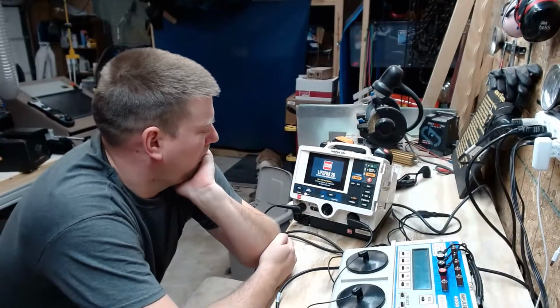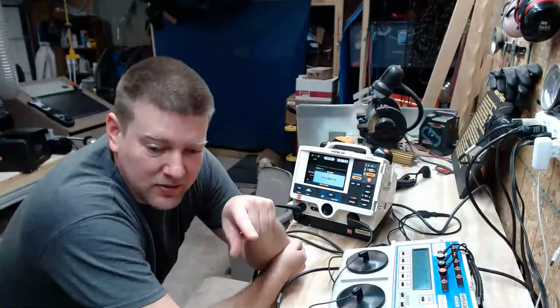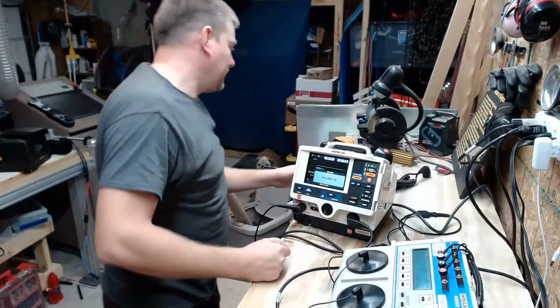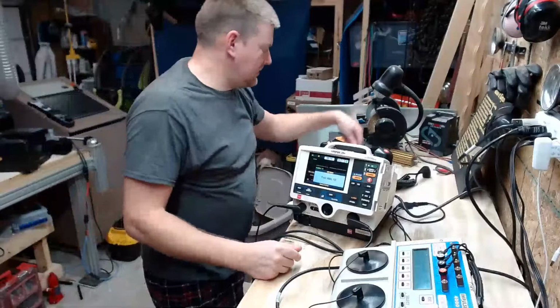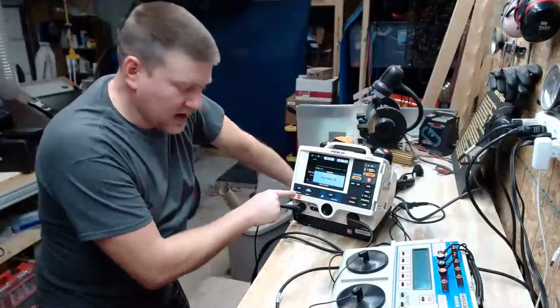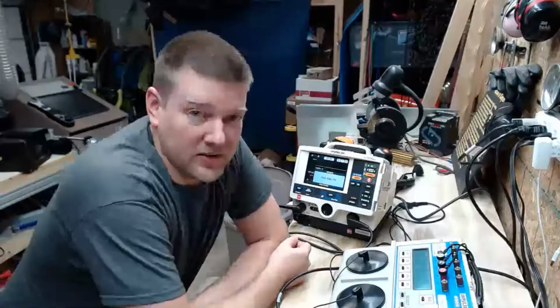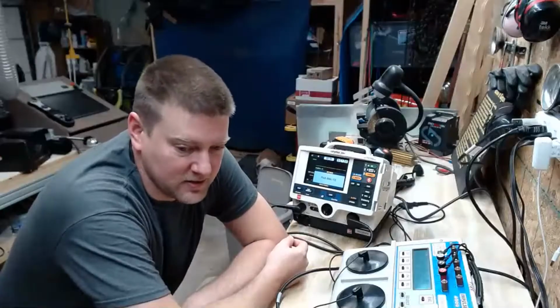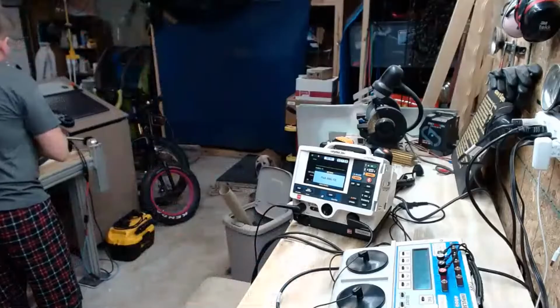Push analyze. That's weird. I'm gonna have to go back through this footage and see what the hell just happened, because it shut off on its own. And currently it's on battery. Make sure that it knows that it's plugged in. I'll tell you right now, this guy's gonna go with me into work tomorrow, and I'm gonna be rough on it. I'm gonna see if I can get it to shut off on its own, just like that again. Push analyze.